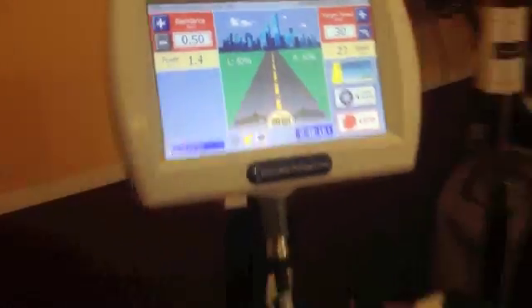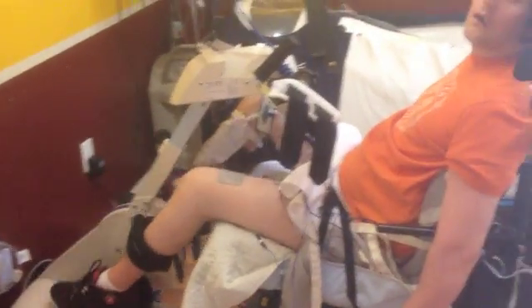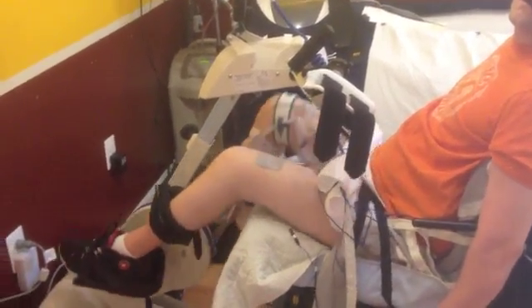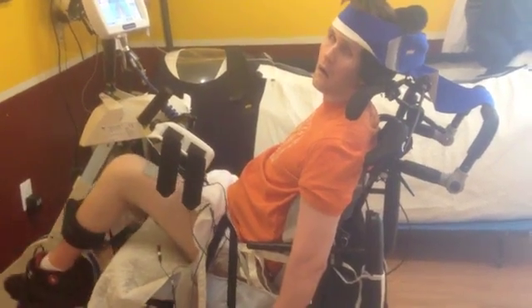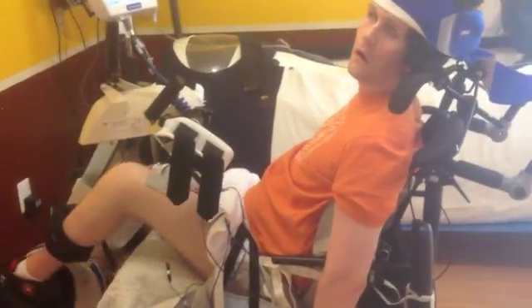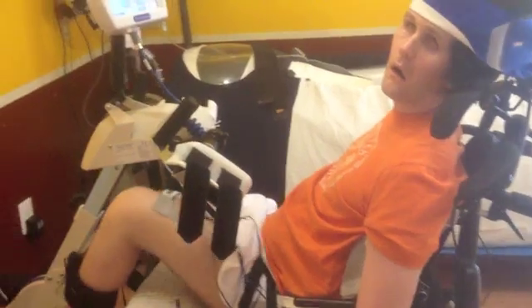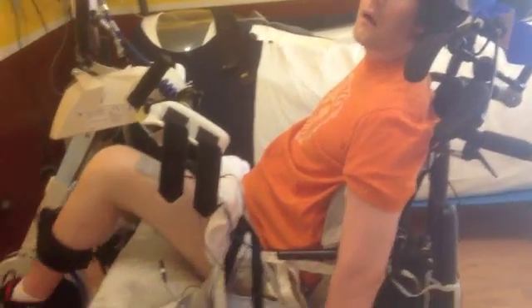His muscles are doing the work again. This isn't voluntary — he's not voluntarily moving the muscles. It's involuntary due to the electrical charge going down through his legs, in alternating and rhythmic patterns. He has four electrodes on each leg: two on the quads and two on the hamstrings. He also has four electrodes placed around the glutes to help push and pull as well.